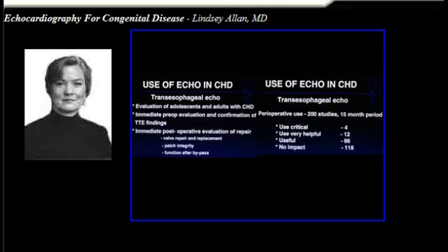And we found that there was only a small number where its use was critical. Its use was very helpful in 12. It was useful in 66, but we would probably have got the information in other ways. And there was no impact in the majority. But that's pretty good in terms of figures.